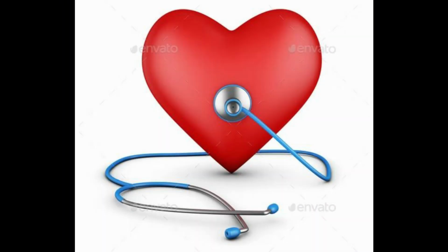So, with the chest piece, you can auscultate the mitral, tricuspid, pulmonary, and aortic areas.